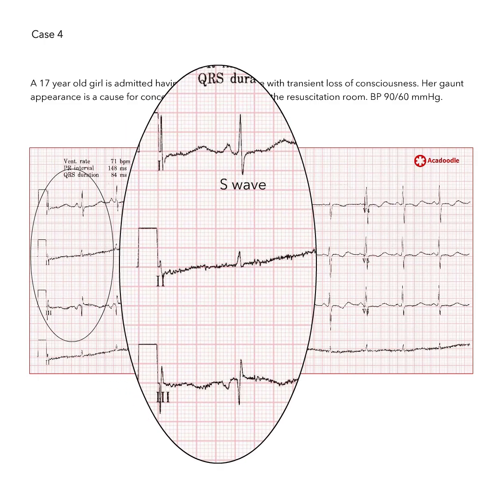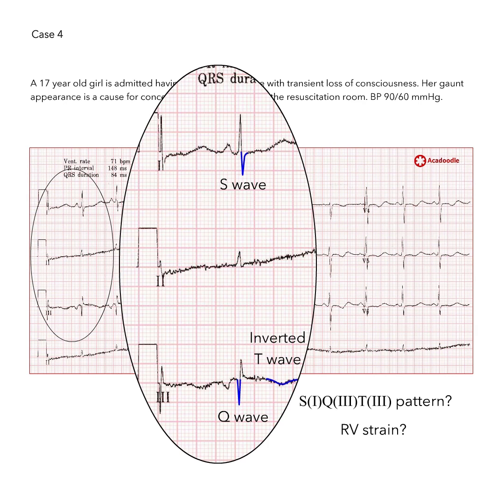There is an S1Q3T3 pattern present in the standard limb leads, raising the possibility of right ventricular strain. Could pulmonary embolism be the cause of this young woman's collapse? Probably not.